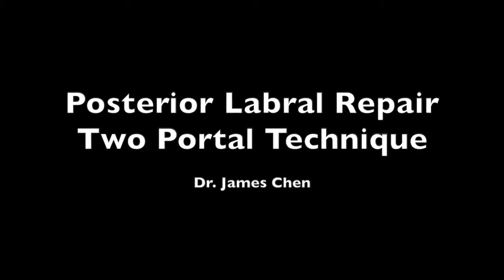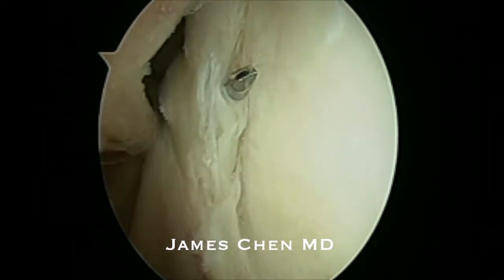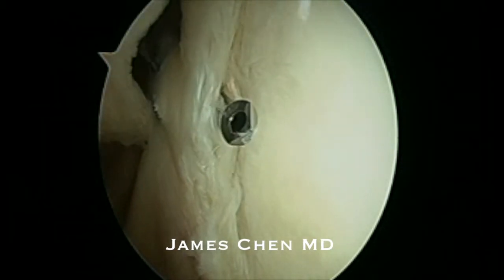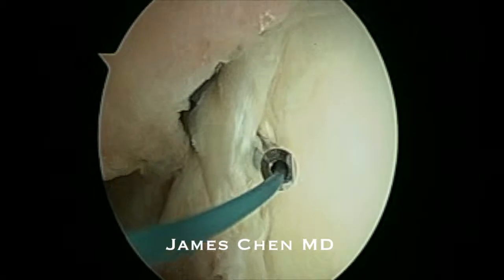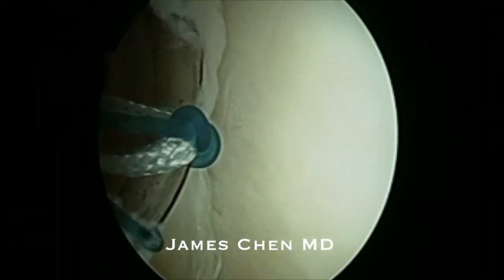This is a video of an arthroscopic posterior labrum repair using a two-portal technique. I am looking from an anterior portal posteriorly. I've already created a posterior portal and I've passed a suture passer through the posterior labrum.